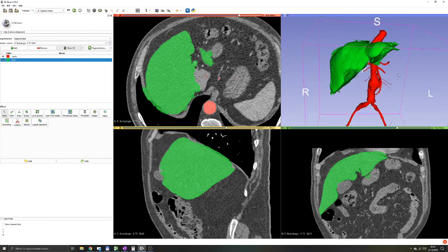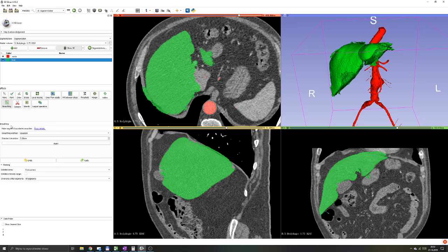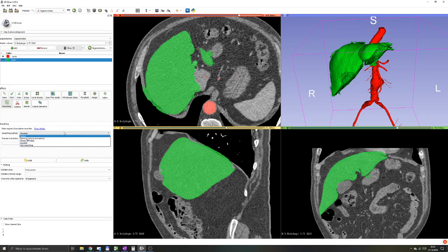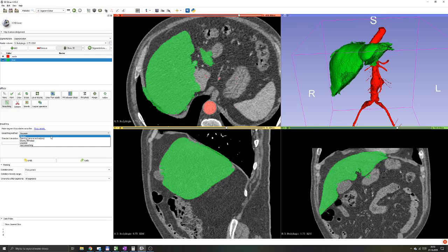The median is an average smoothing algorithm which is relatively weak and doesn't show you extreme results, so it's good and safe if you want to do just a little bit of smoothing.